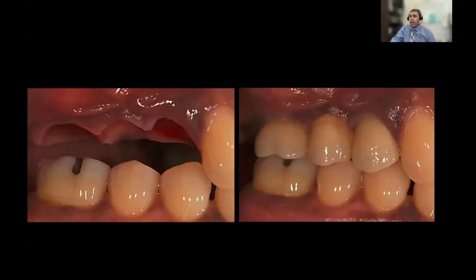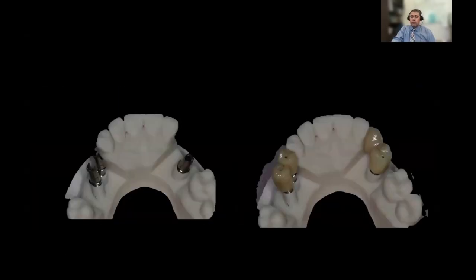And here's a patient where we treated with 2 dental implants and ovate pontics in the posterior segment, stopping at the first molar and achieving exceptional aesthetic and functional outcome. You could appreciate that we have a lack of interocclusal space, which also has an effect on the depth of the placement and managing the soft tissue to achieve a very good outcome.